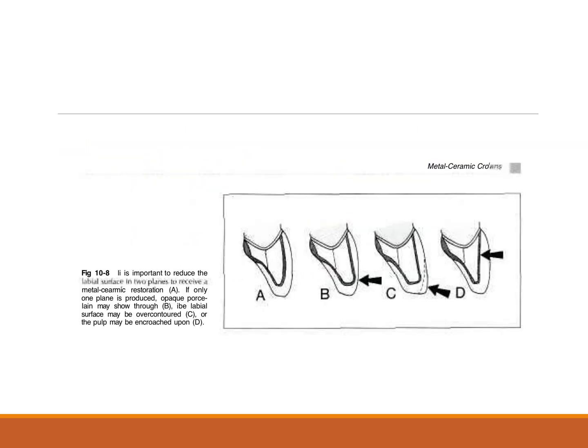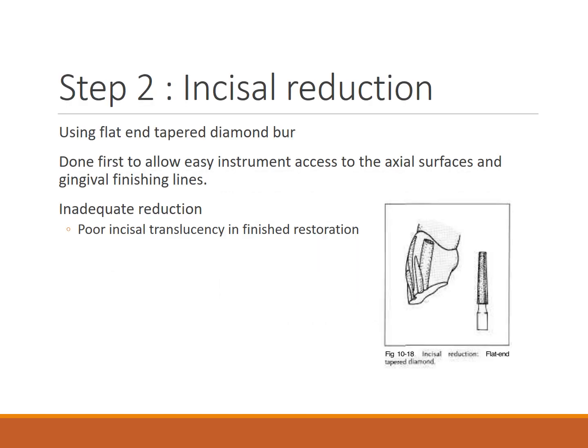So I have a photo to explain that. Here there can be an exposure, there can be too much taper, and this is too thick, so it should be almost proper. So one and two planes, guys, okay? So you're not too close to the pulp, if in case it's not RC treated, or even if it is RC treated, okay, guys? So you have to know the two angles. We have to know the angulation of the burr.